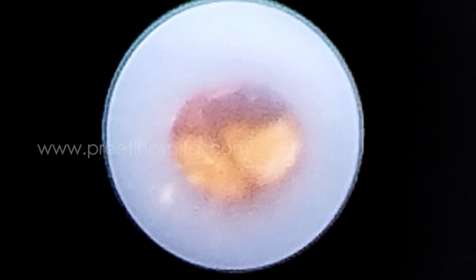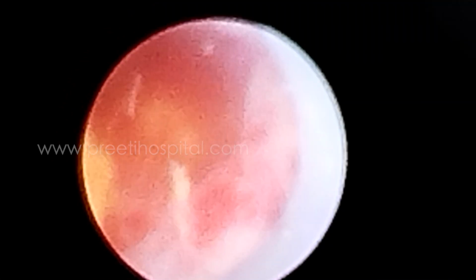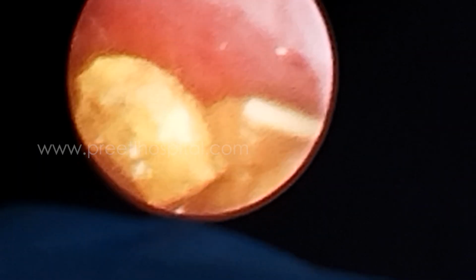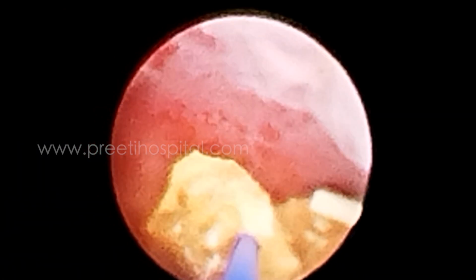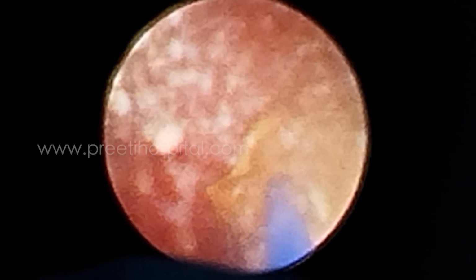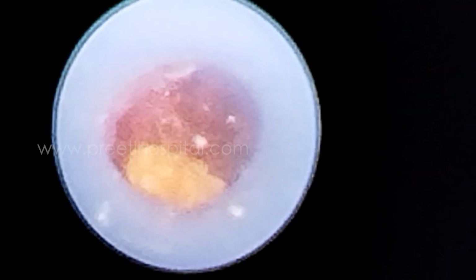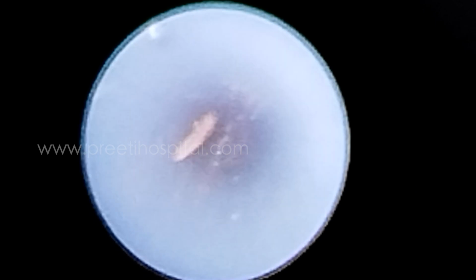Give me the laser. See, this piece breaking with pneumatic is difficult because it will go into upper calyx, PUJ, and then you are flushing. All things will be there. If you see from a distance, see, in no time, finished. Got the point what I'm saying? Finished. Now it will come out. So, with this only it is taking this much time. If you do powder, it will take more time. Powder is not the aim in PCNL.